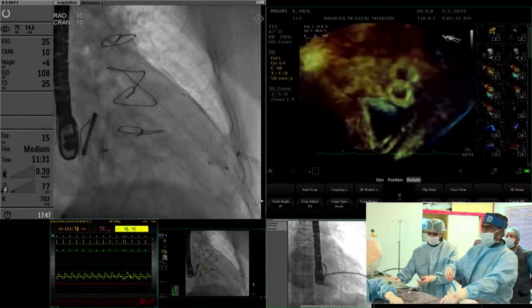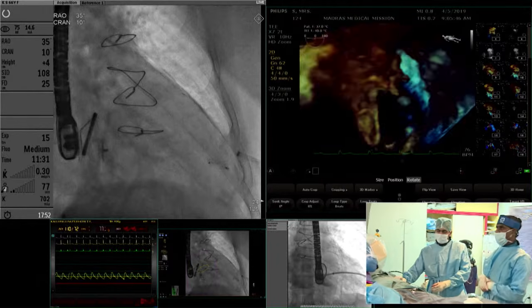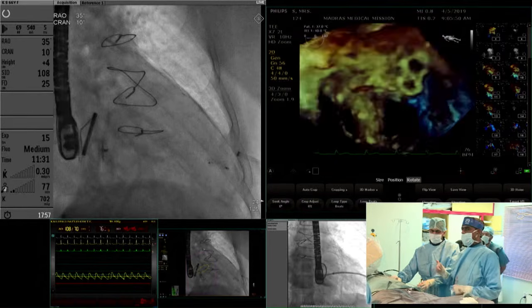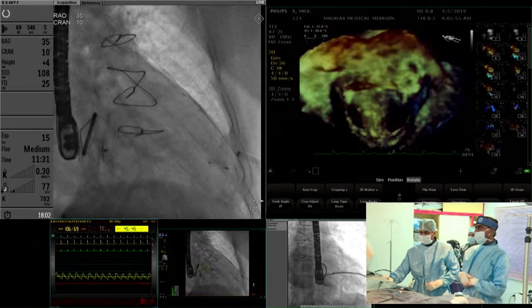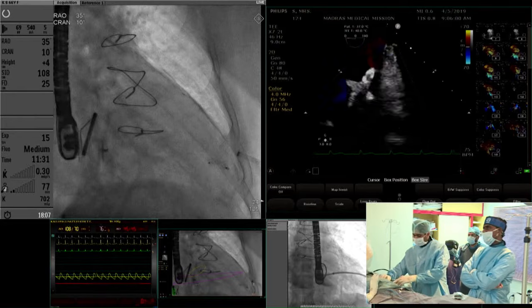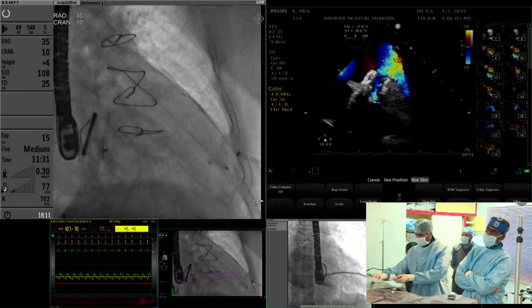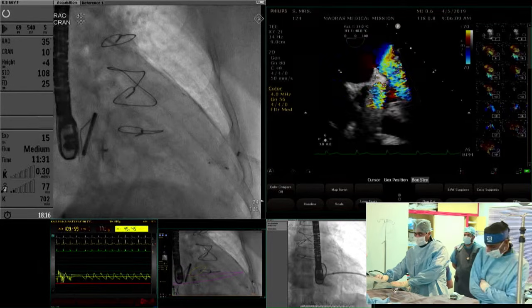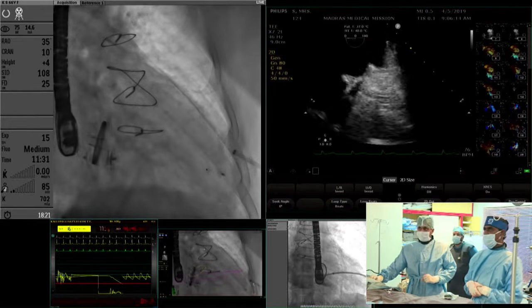So right now we will concentrate on the echocardiography. Dr. Srija is showing a live echocardiogram. The plug is in the anteromedial position. The aorta is seen at the apical part, at the 12 o'clock position. Srija, show some live color. Yeah, so the device is okay. You see, hardly there is any big leak there. It looks nice. Can you see that, Dr. Raj? Yes. So now I'm making a final check on the fluoroscopy.